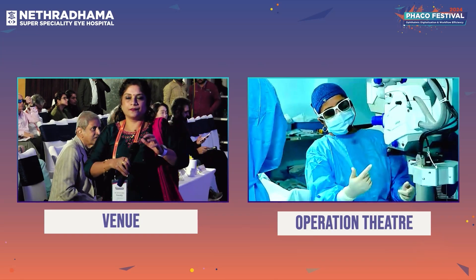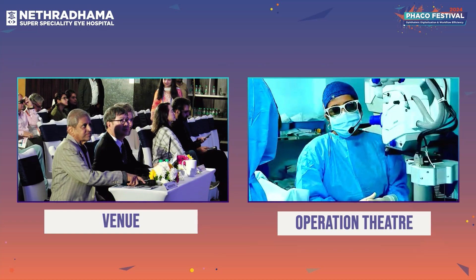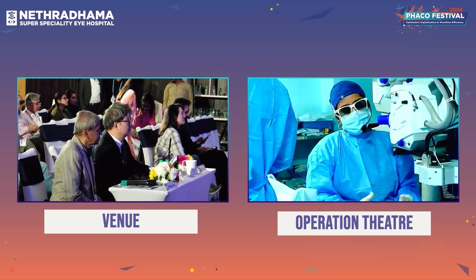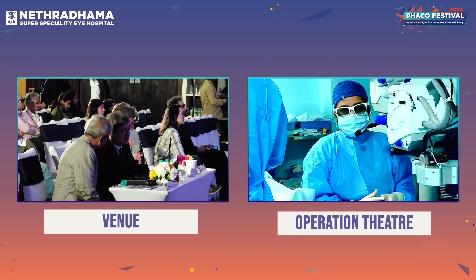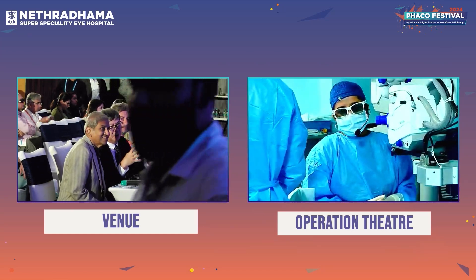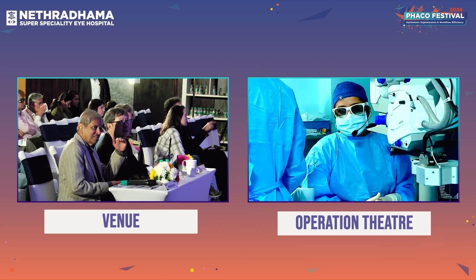As you can see, the laser is attached to the microscope. There are a few advantages — it is a laser cataract surgery on a different platform. The laser is directly attached to the microscope, so the footprint in the OR is virtually none. You don't have a big system that needs to accommodate space. It's a 590 nanometer solid state orange laser.